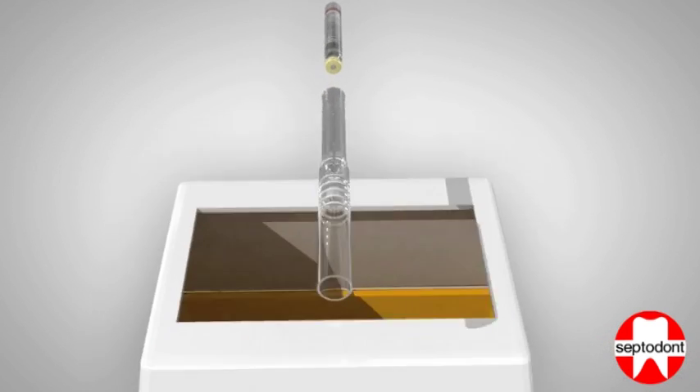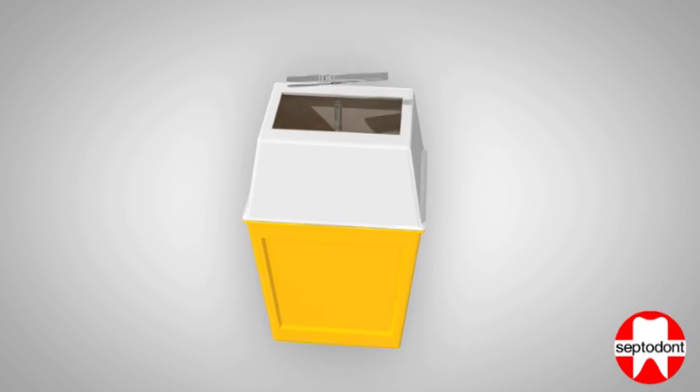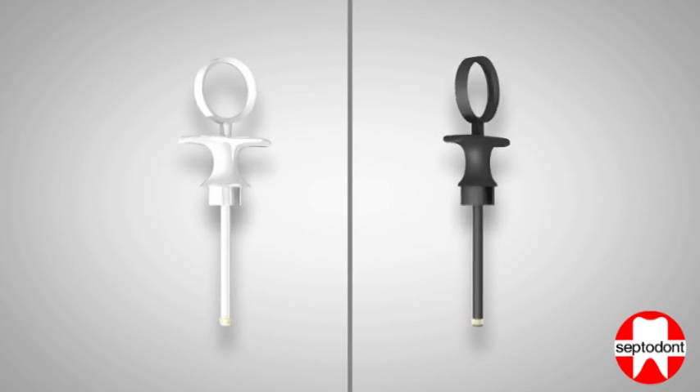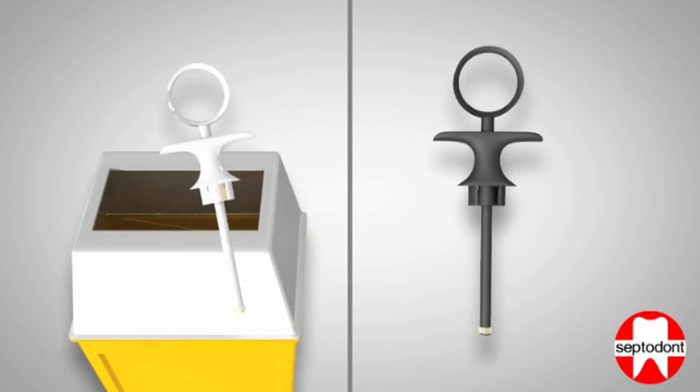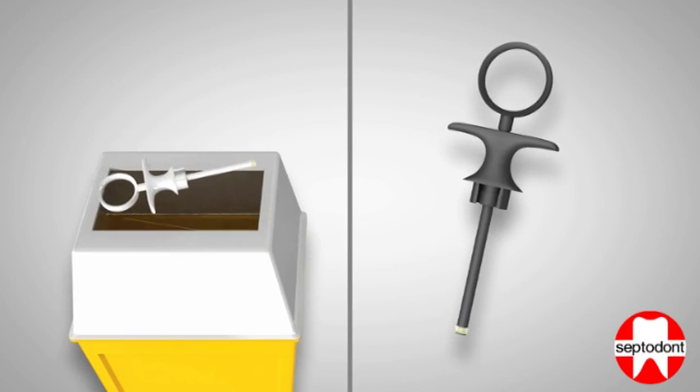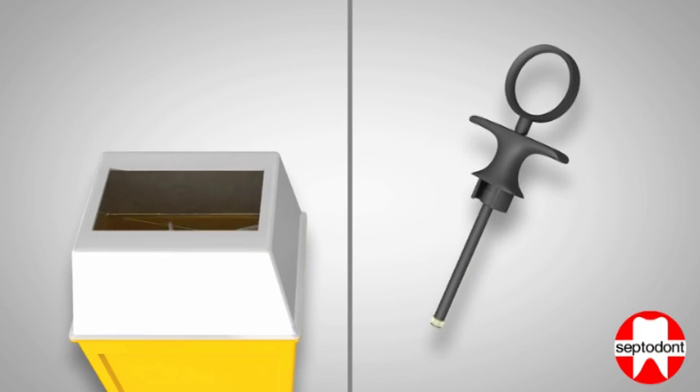Now the injection device can be disposed of safely. If you are using a white single-use handle, it can be disposed of as well. If you are using a black polycarbonate handle, it can now be sterilized.